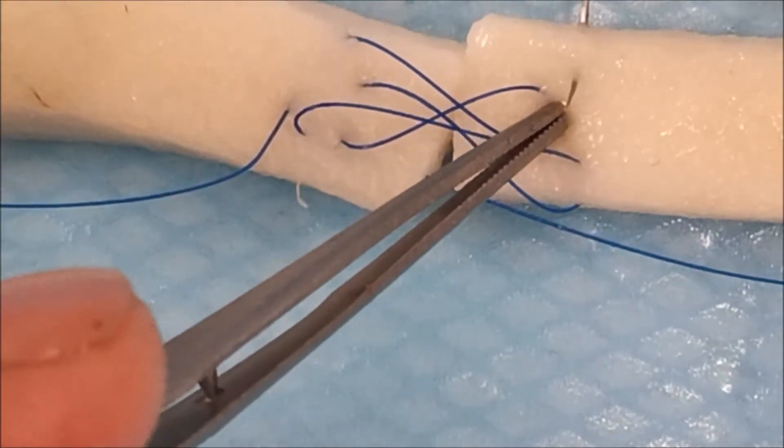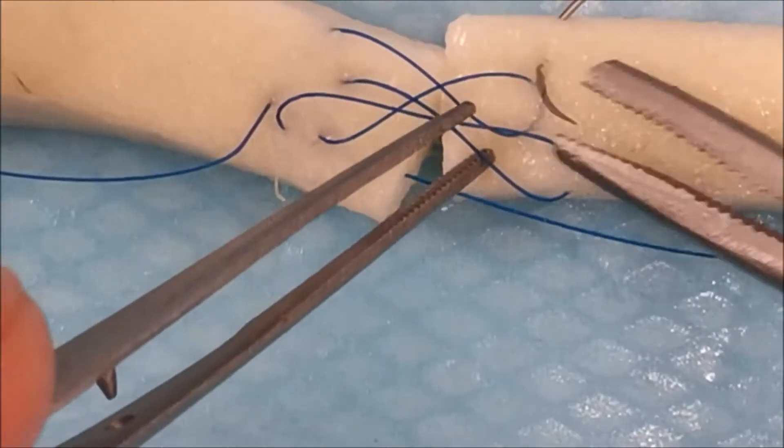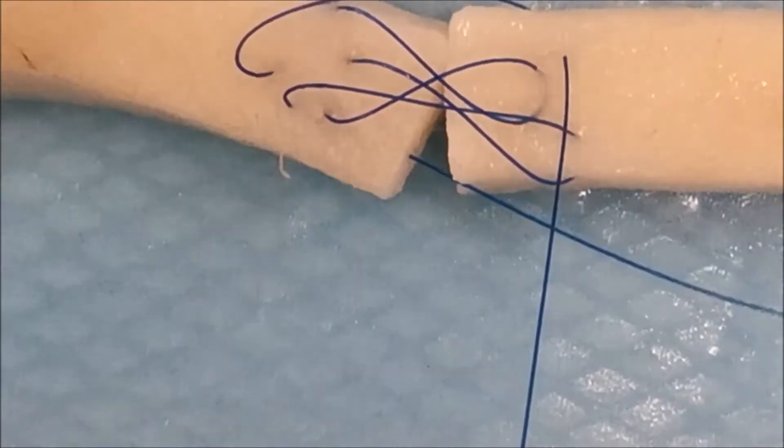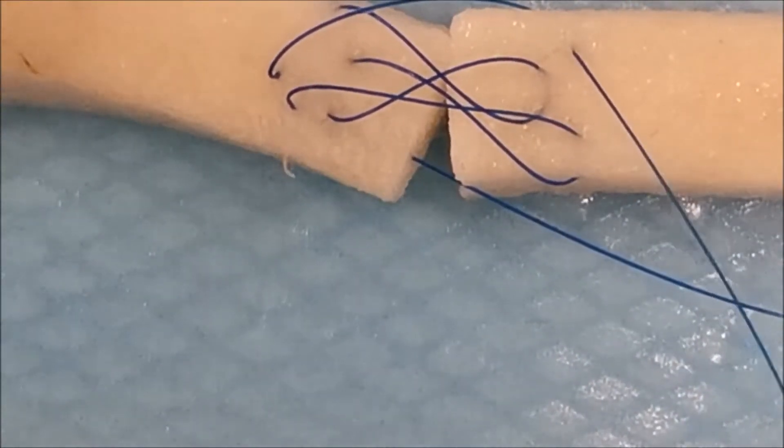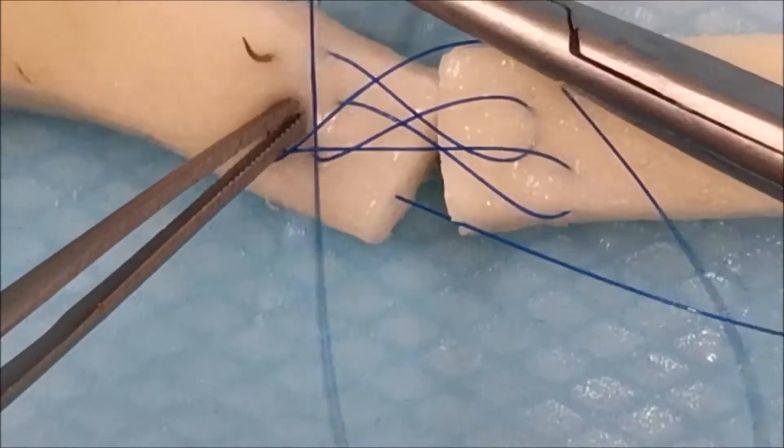Once you have completed this, it will gather the tendon ends and any stray tendon fibers in order to ensure a smooth glide.